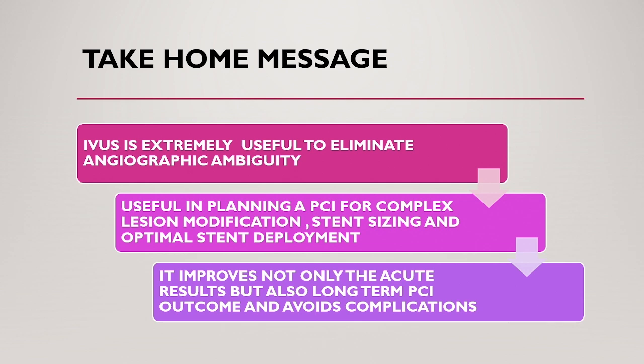And after deploying the stent, under expansion is the single most important predictor. One has to be very careful. Simultaneously one has to look for geographic miss and other major dissection or hematoma, and it improves not only the acute result but also the long-term outcome.